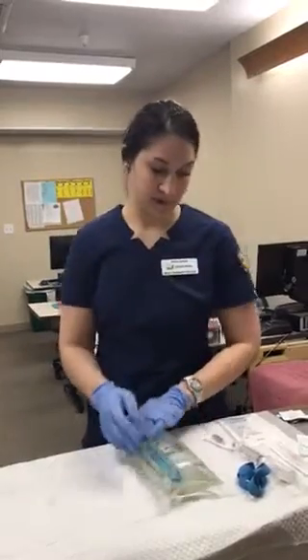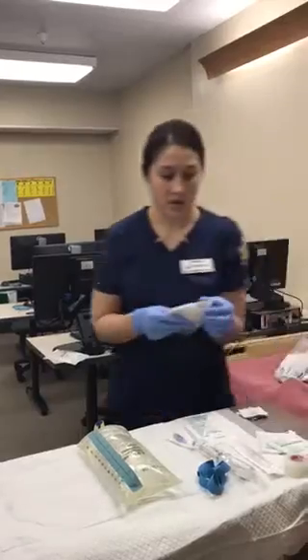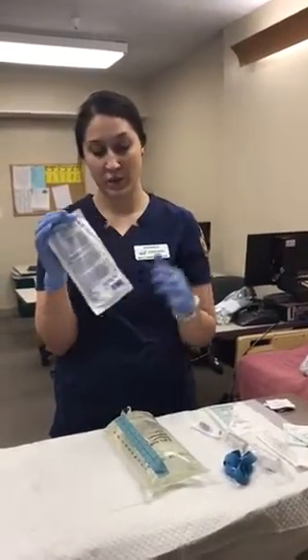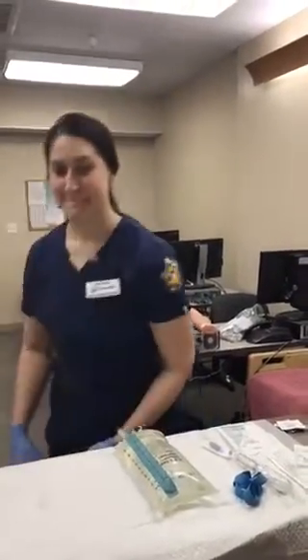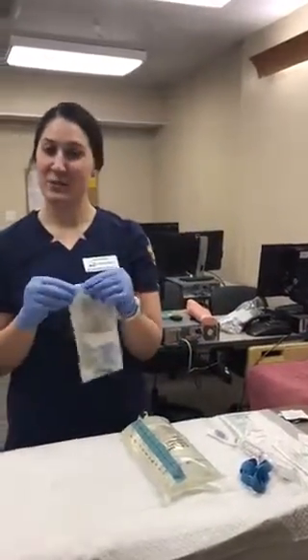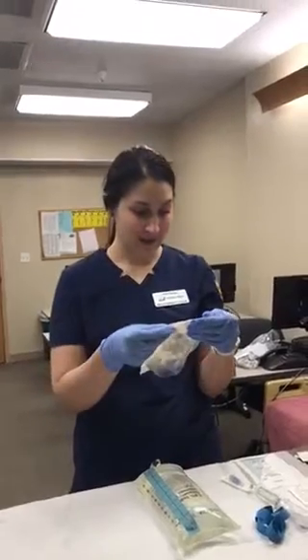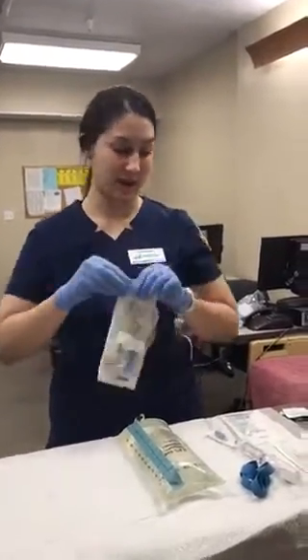My next step is to go ahead and remove the tubing. So I have selected this, a 10 drop per mil, which is the appropriate tubing for the solution that we are administering. I would get a clean one of those because I just dropped it in the garbage, but yes, it is still sterile. So this is a continuous flow solution set, which is the correct one.